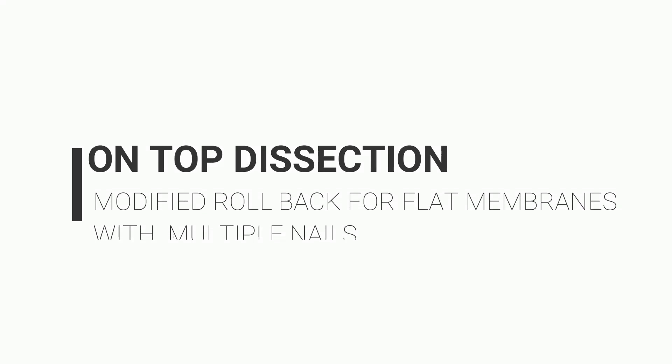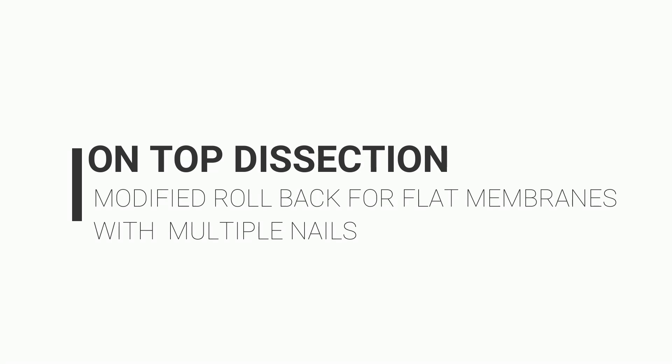Fibrovascular membranes with closely placed vascular epicenters are sometimes difficult to dissect, and often bimanual dissection is needed. This video demonstrates a simple unimanual technique which is helpful in these situations.